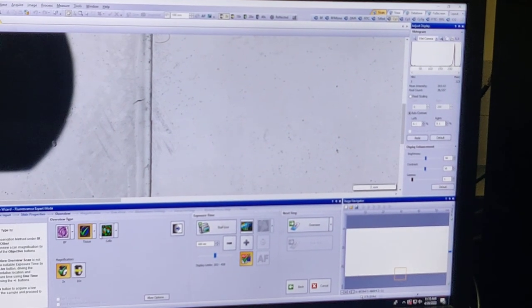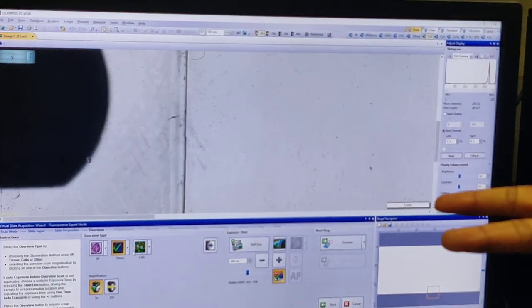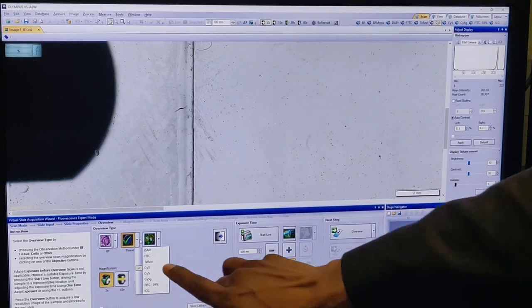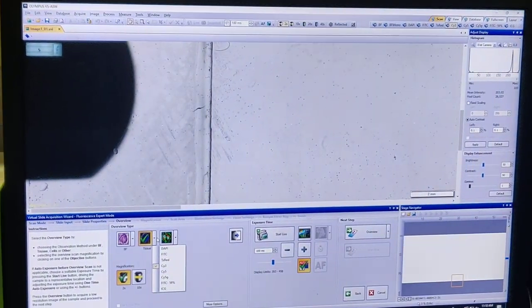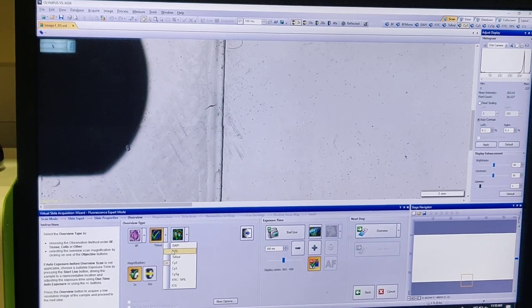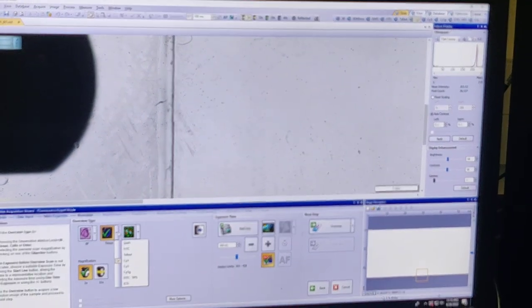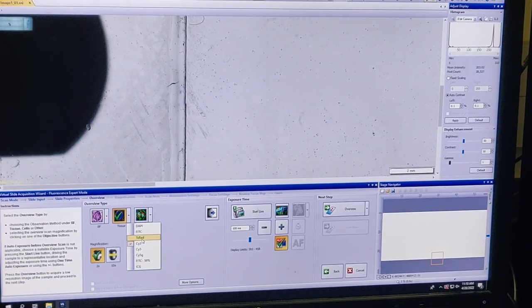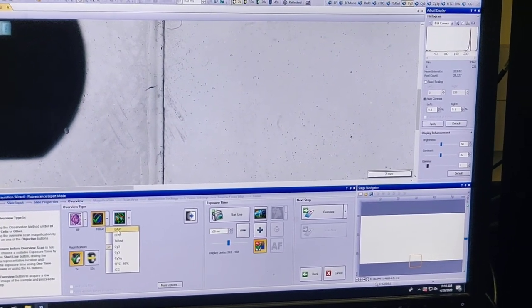The sample I placed has three colors: 405, 488, and 561 nm — which correspond to DAPI, FITC, and Texas Red. In my sample I already know Texas Red is the brightest, but usually we don't know, so we begin with any particular wavelength to test. I click the scope, select DAPI, and go to live view.